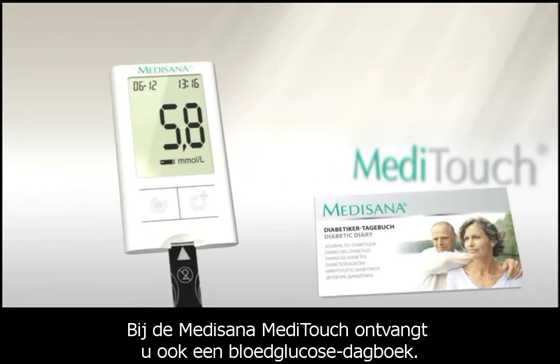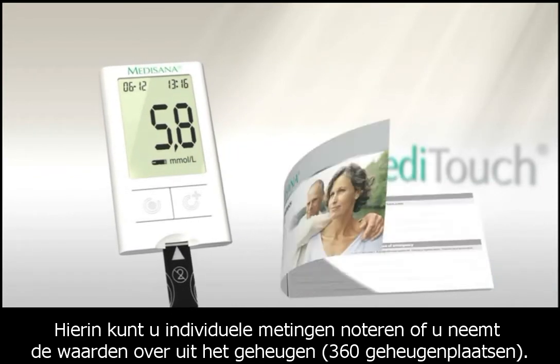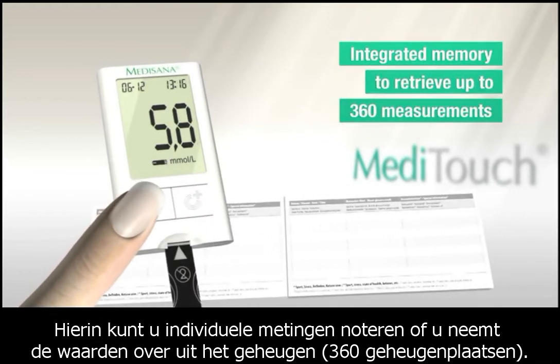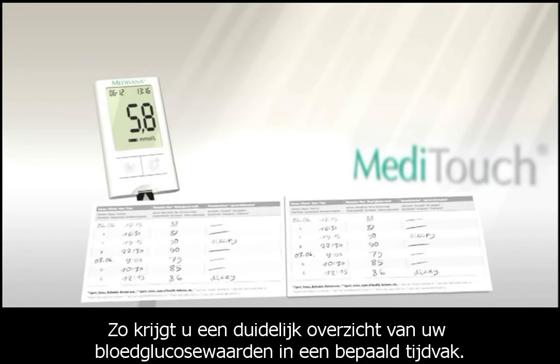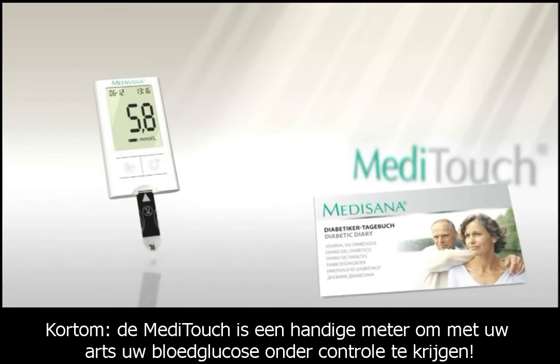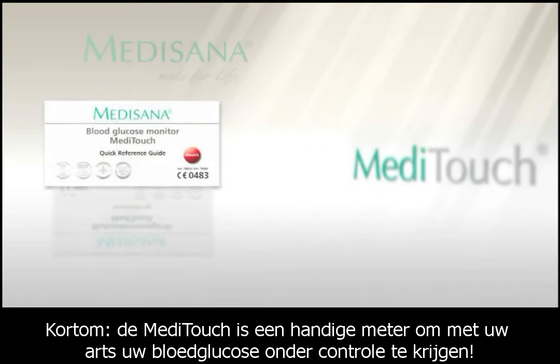The Medisana Meditouch also has a diary function that allows you to record individual readings, as well as an integrated memory to retrieve up to 360 measurements. This allows you to check your blood sugar levels over time, which may be useful to give to your doctor to help with your treatment.